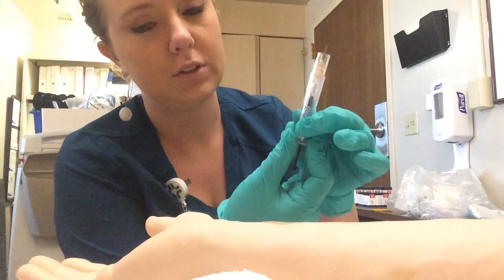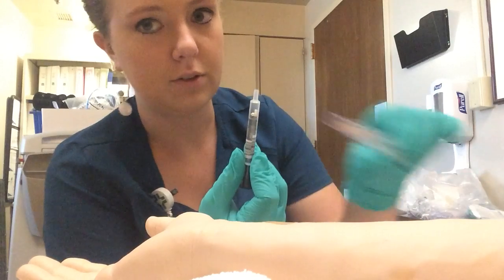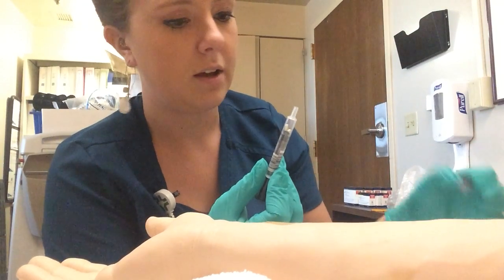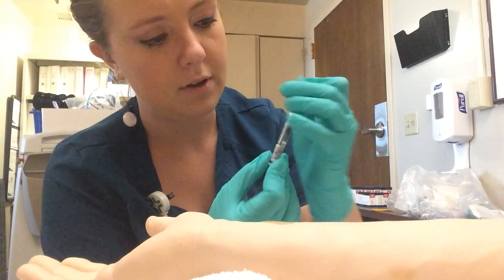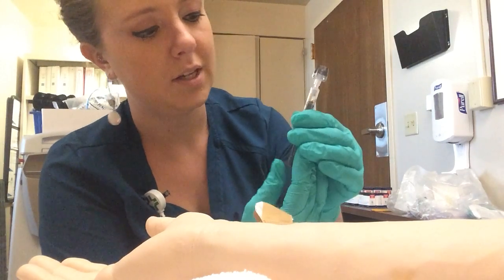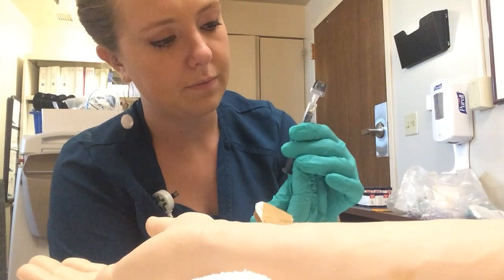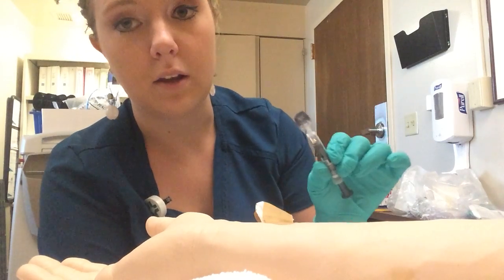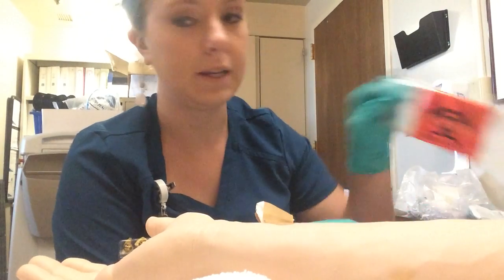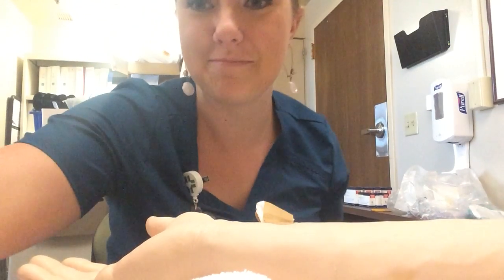With these syringes, the needle just pops out like that, and then you dispose of your needle in the sharps bin. Take my cap and push it on really hard until it clicks. Squeeze out any air. Then put the patient label on that and double bag it in my biohazard bag, and set it off to the lab. And that's it.